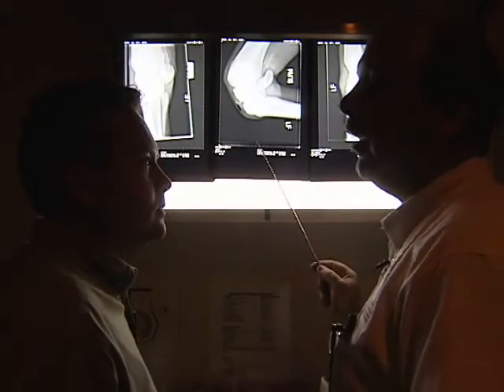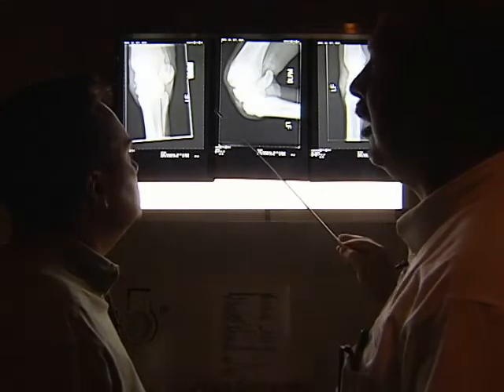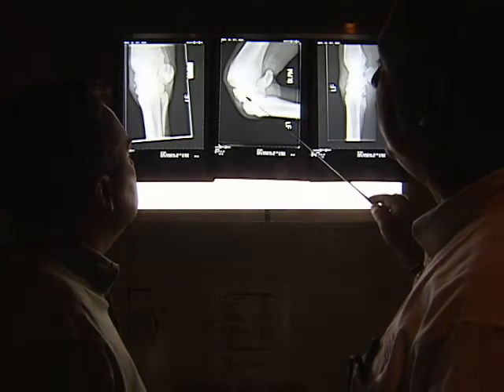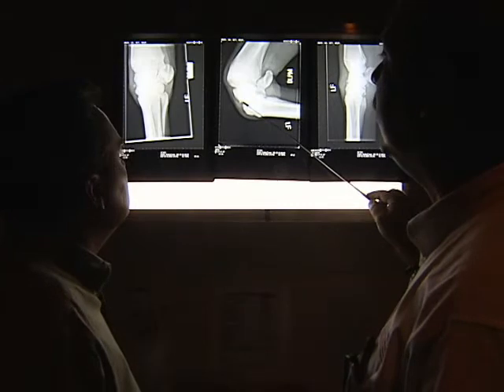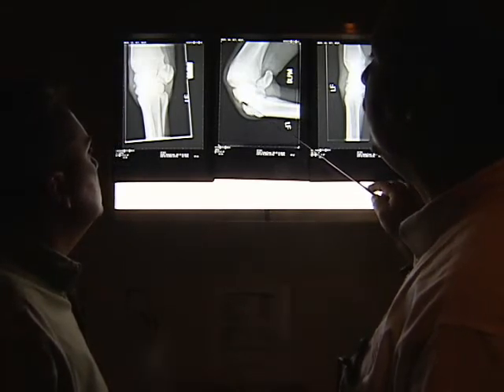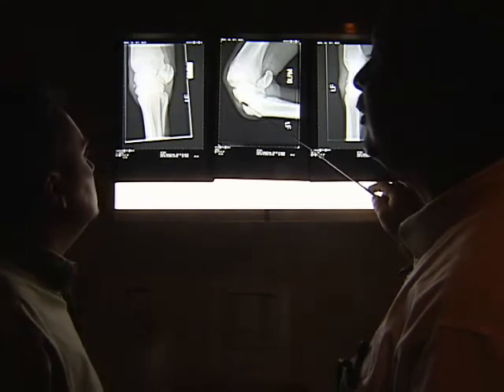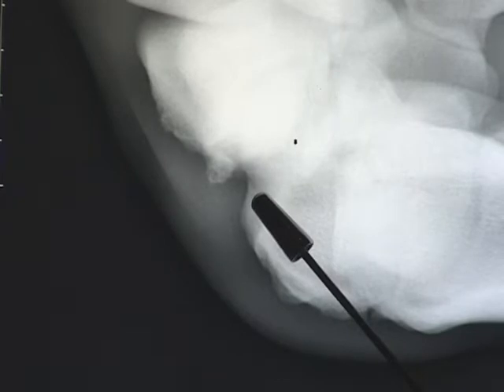What we're doing here today, Ryan, is looking at these x-rays to see if they can pick up where we're having this performance problem. If you look right here, this flex view, an angle view of the carpus, it shows that we've got an osteophyte, a little chip sitting right here where this joint flexes. What this does is interfere with the horse when he's flexing his joint, as the tendons cross across the front part of this joint.